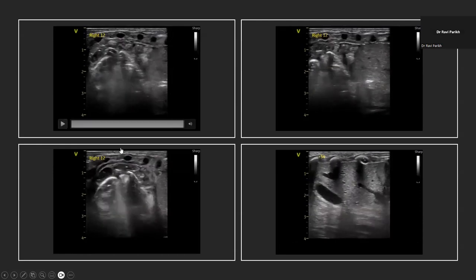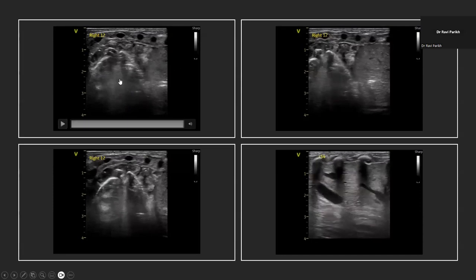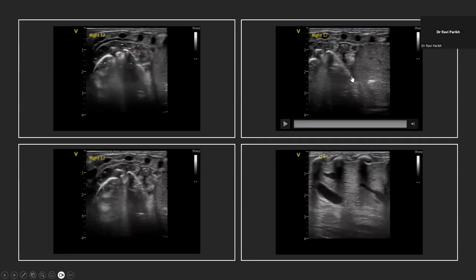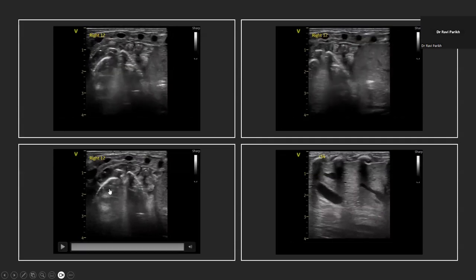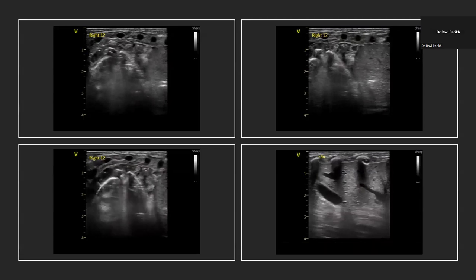Does it? Anybody? As clinical background, the same presentation could be a hernia, could be a totally collapsed lung, or a massive effusion.